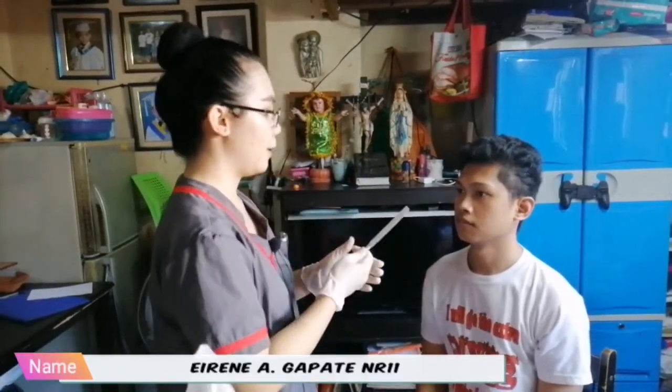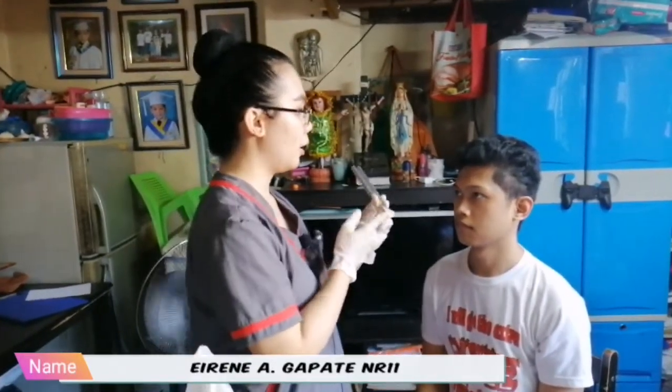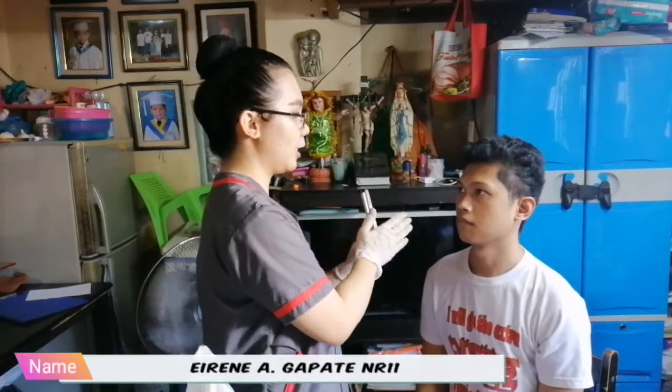And sir, gagamitin ulit natin to, tapos tutunugin ko ulit siya. Then, ilalagay ko naman to ngayon dito sa inyong noo. Then, sabihin nyo sa akin kung saan nyo narinig yung sound. It's either sa kanan, sa kaliwa, or pantay lang.